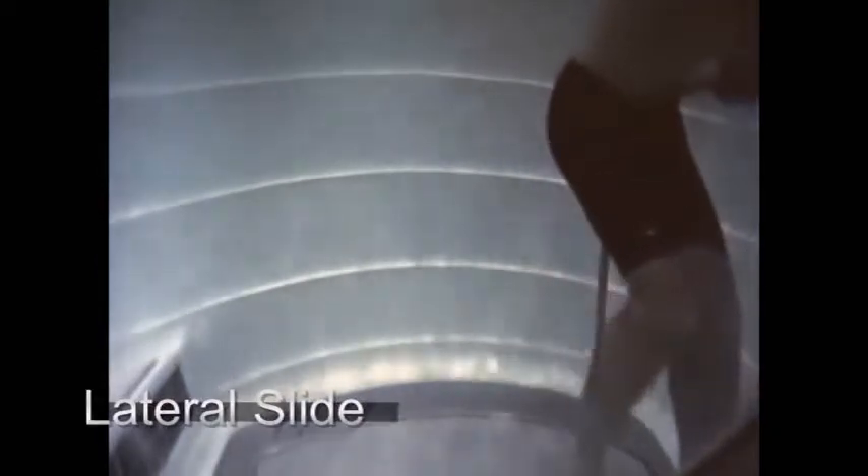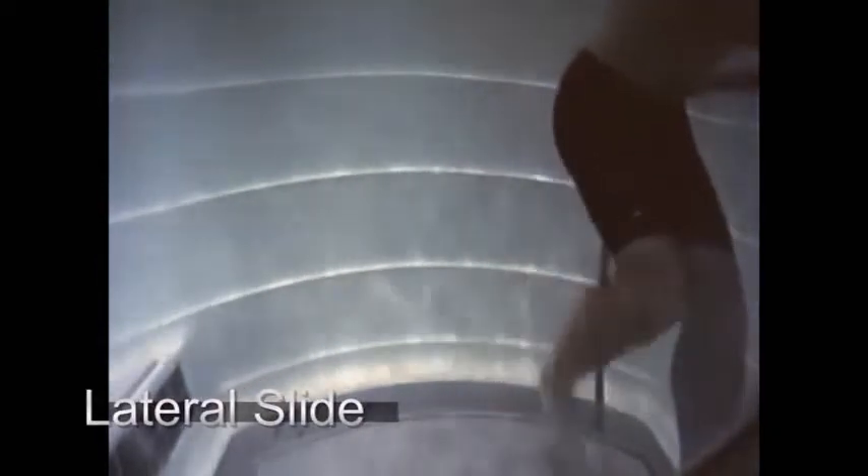On the lateral slide, both legs are on here — the involved and uninvolved leg off the treadmill, and the other one sliding and bringing it back — because you're using both the right and left adductors: one for stabilization, one going through the range of motion. It really depends on how sore it is. If you just let the treadmill pull it out to the point of stretching it, whether you bring it back hard or let it kind of float back depends on how sore you are. The treadmill just takes it out — that's just working on range of motion right now.